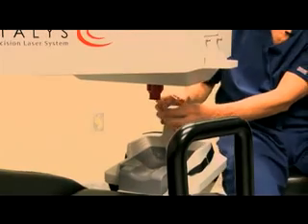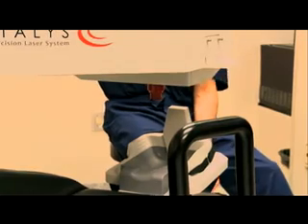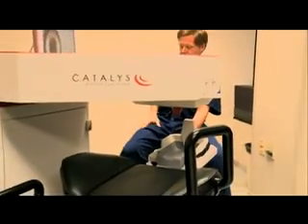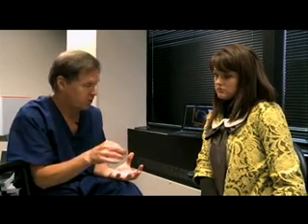And how does this machine make it so precise? I mean, because that's what I'm hearing. How does it get it so precise? Well, the first thing is the imaging. There are a couple machines that do this, but this imaging does it with a water bath, so it doesn't distort the iris tissues and the corneal tissues, so it gets a good strong image. And that allows more precision in the actual incisions that it makes.